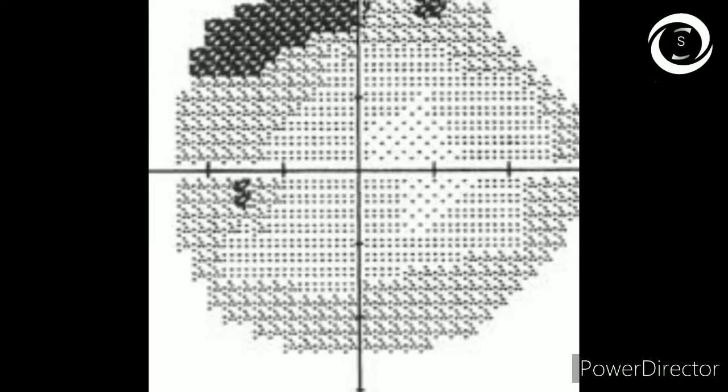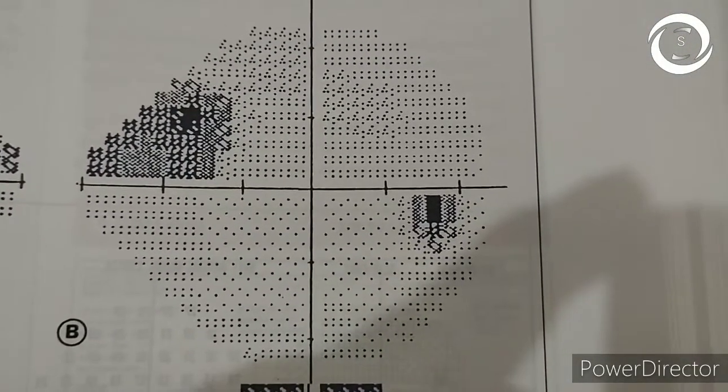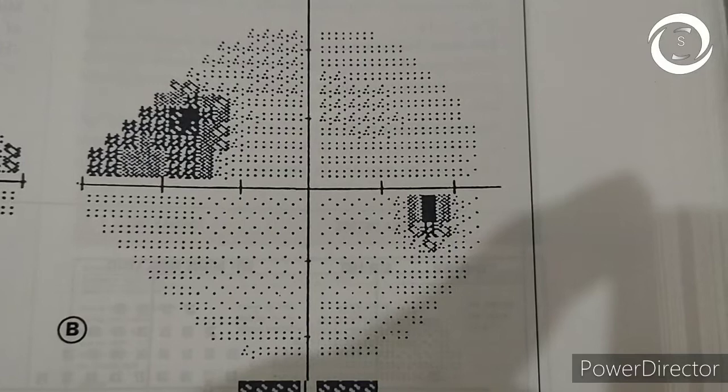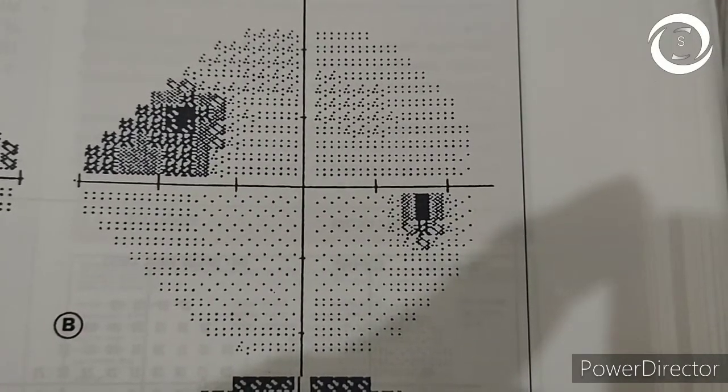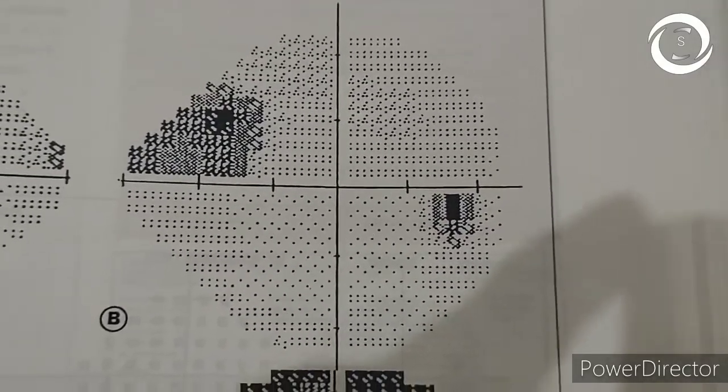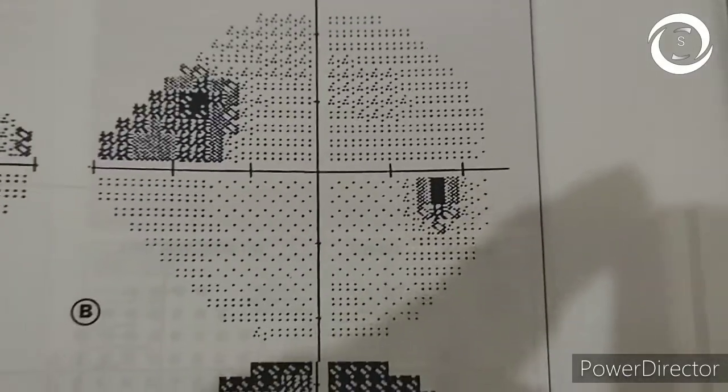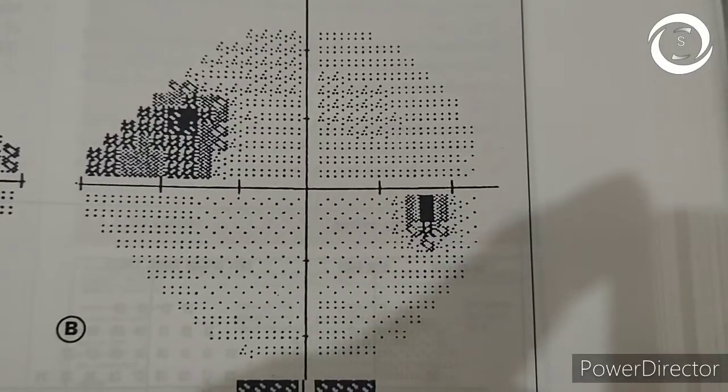Now comes to the nasal step. Again, see the blind spot. Nasal step is always opposite to the blind spot. Here nasal step is seen on the left, superior to the horizontal midline, and it represents the difference in sensitivity above and below the horizontal midline in the nasal field.